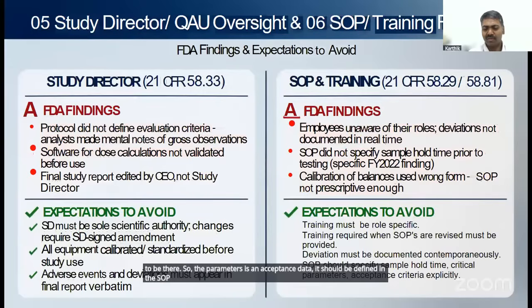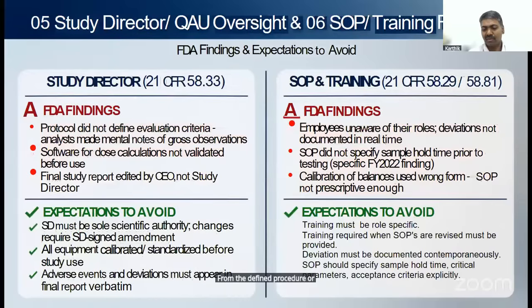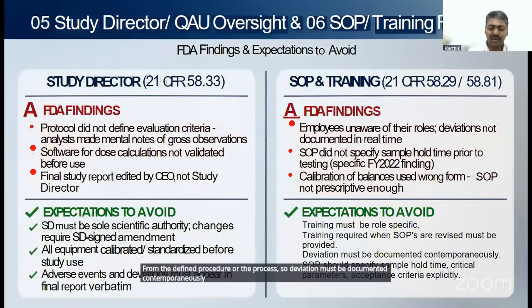And if anything has deviated from the defined procedure or the process, the deviation must be documented contemporaneously. To avoid the FDA findings, this has to be done.